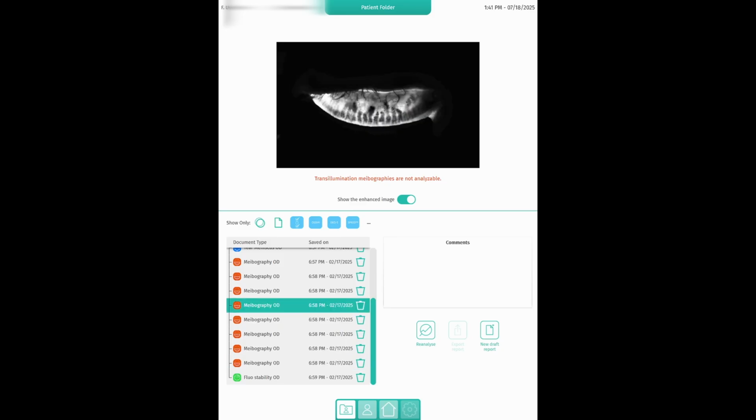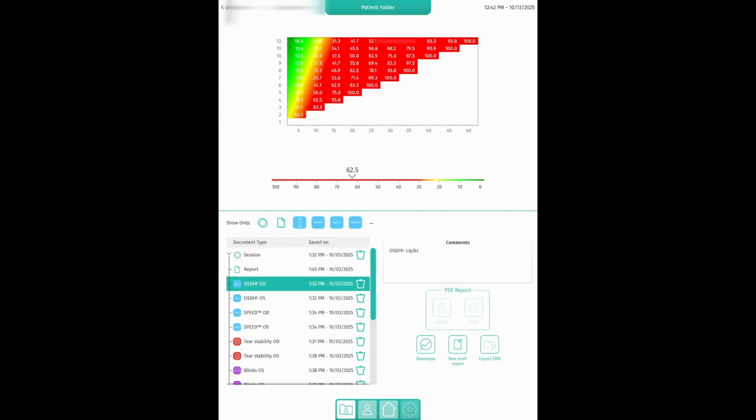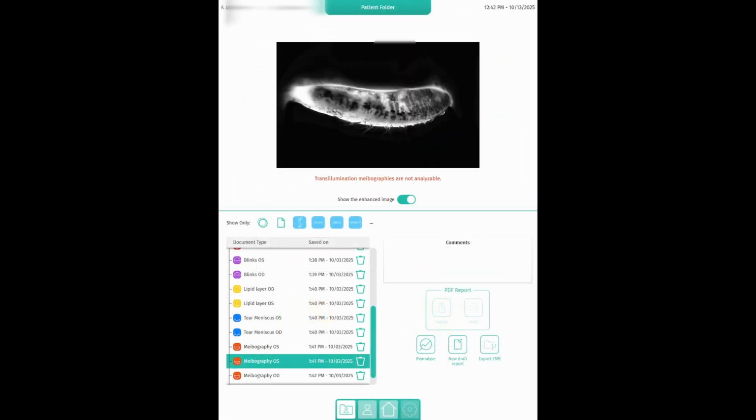Overall, Quantel C.DIAG stands out as a reliable, well-designed anterior segment diagnostic tool. It combines user-friendly operation with AI-based diagnosis and also a proposal of the treatment that fits the modern ophthalmic workflow. If you're looking for an efficient, space-saving diagnostic solution, C.DIAG is definitely worth a closer look.